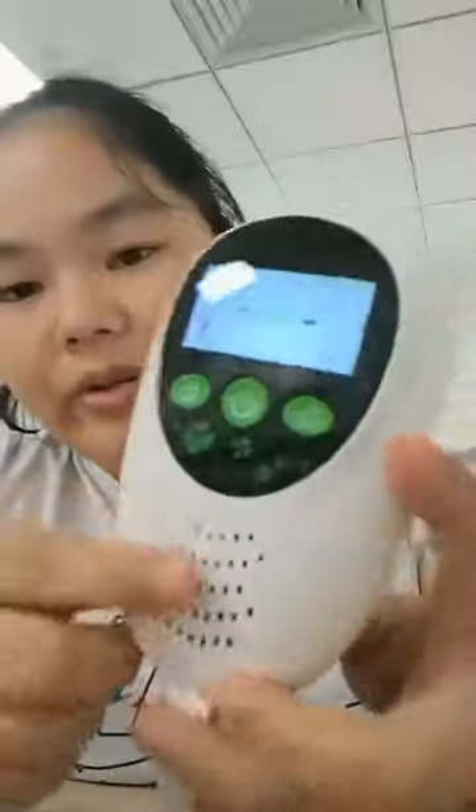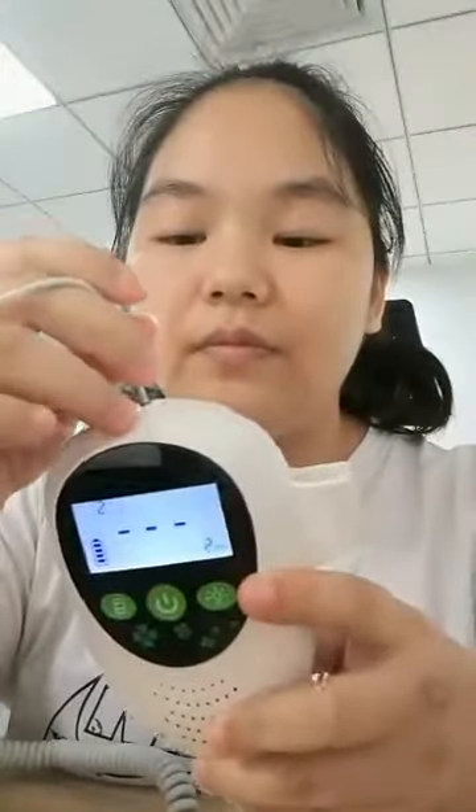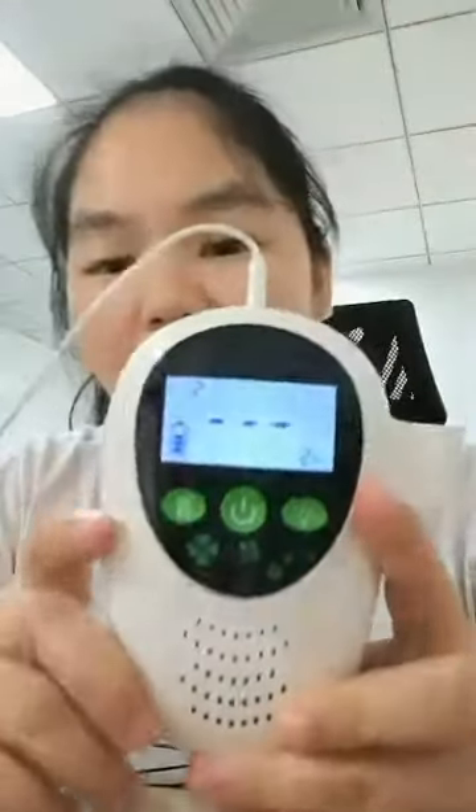It has built-in loudspeakers. Also, you can insert the headphones on the top. And now you can begin the monitor.